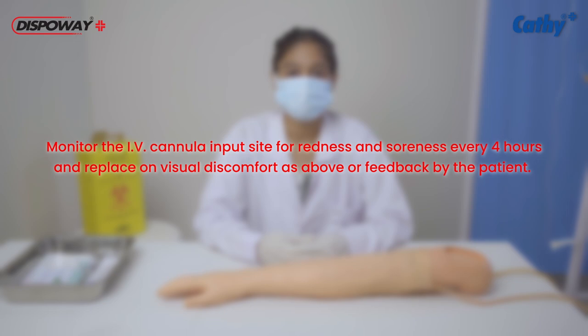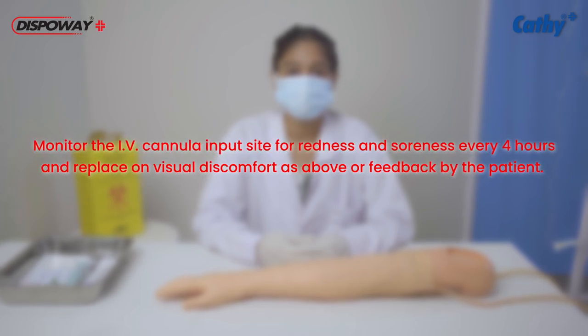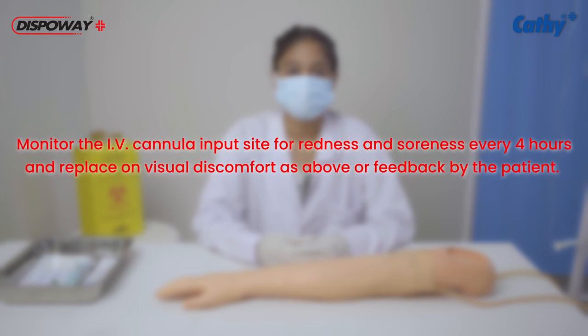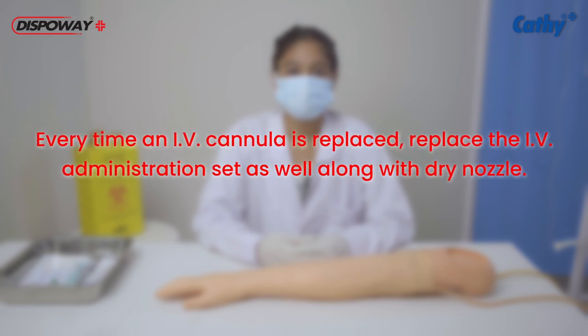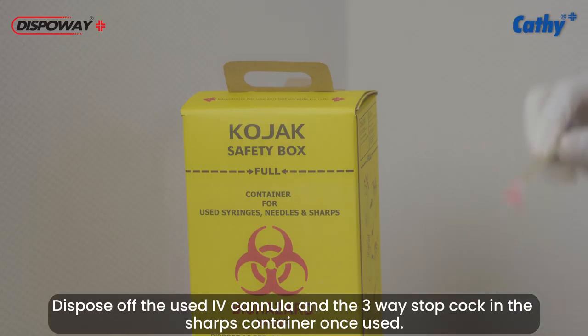Monitor the IV cannula insertion site for redness and soreness every 4 hours and replace on visual discomfort or feedback by the patient. Every time an IV cannula is replaced, replace the IV administration set as well along with the drip nozzle. Dispose of the used IV cannula and the three-way stopcock in the sharps container once used.